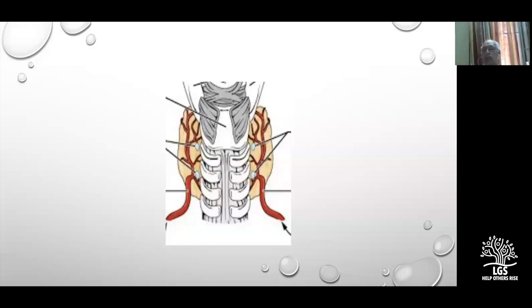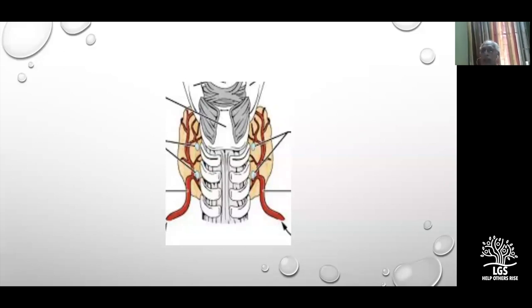At the lower pole, lift up the right lateral lobe off the trachea and thyroid cartilage. My method is to start from the posterior aspect, identify the posterior border of the thyroid gland, and gently lift it up from the trachea and thyroid cartilage. Do not start dissecting anterior to posterior as that puts abnormal stress on the posterior border and increases the chance of vessels tearing. Start posteriorly and work forward to the midline.